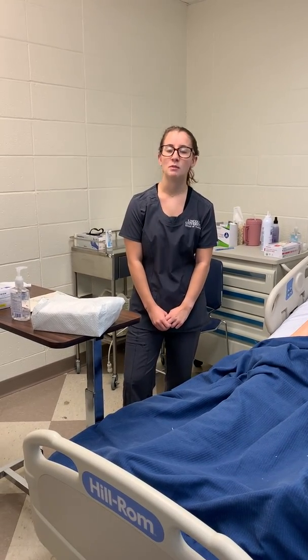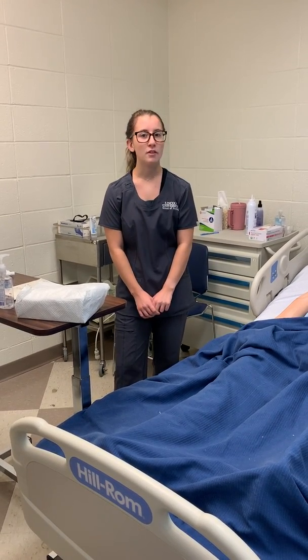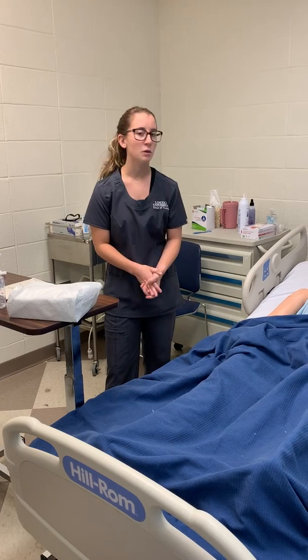I'm Gabby Karatka, a first semester nursing student. Today's date is 10/31/19. It's 8:45 and I'm going to do a female indwelling catheter.